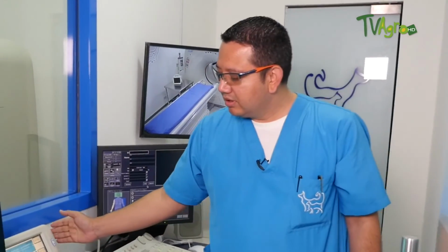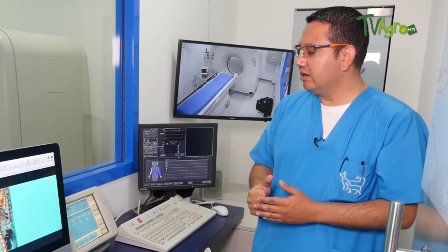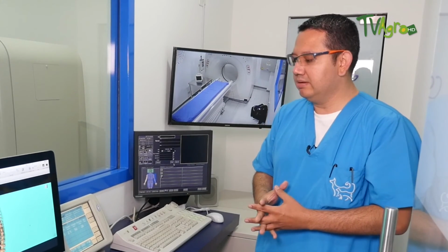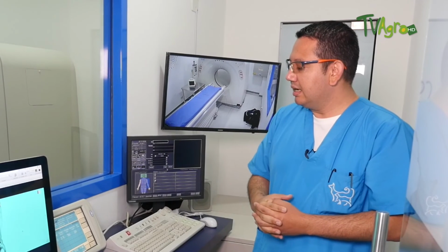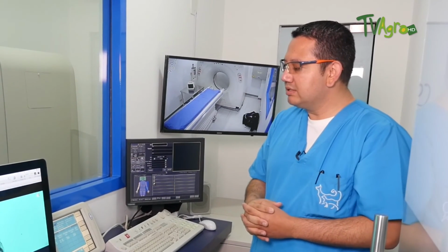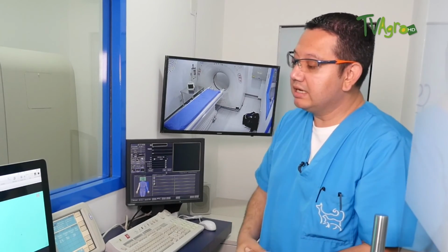We also have the monitor of the contrast medium injector, where we set the volume and the flow with which we inject the contrast medium. This depends on the weight of the patient and also on which vein we have and which catheter we are using, to know how much contrast and how much flow we will use.